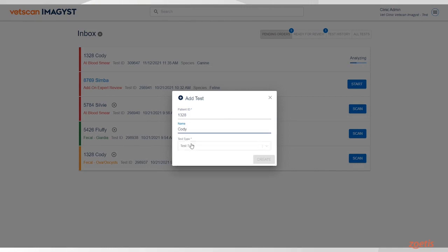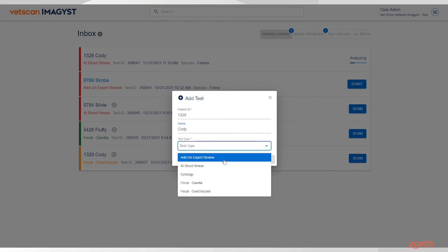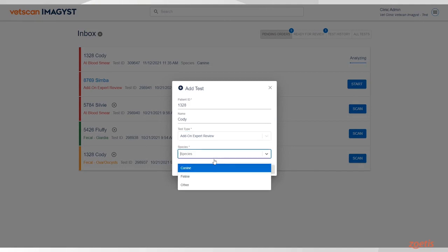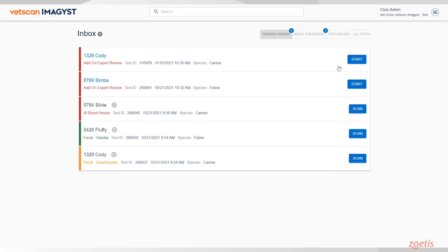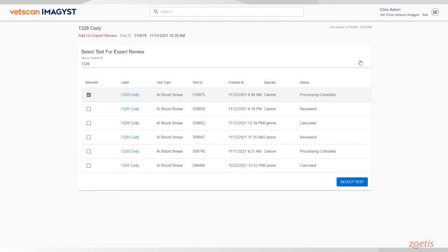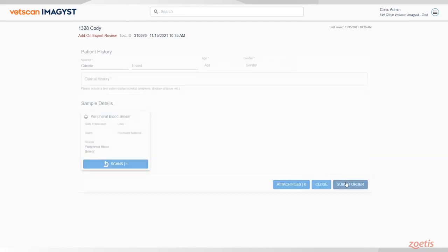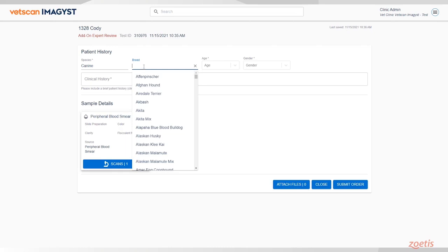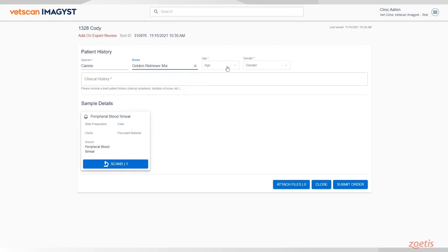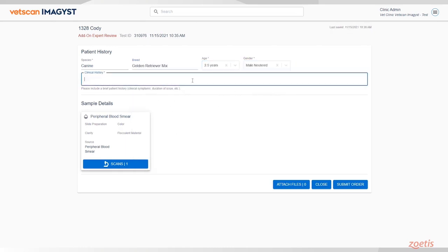Enter the same patient ID and name from the AI blood smear. Select Add-on Expert Review and click Create. The most recent results from the patient will be automatically selected. Verify the selection and click Select Test. Enter information for the patient's breed, age, and gender. The patient's species is already set.